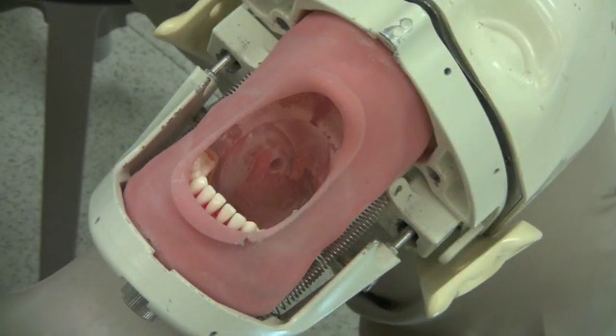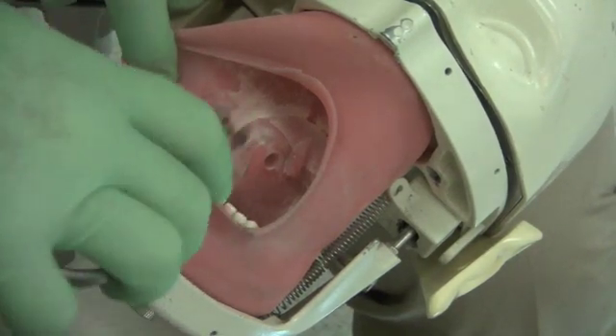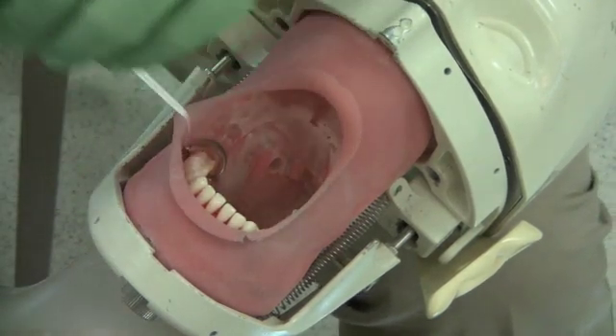The following video shows the steps for rubber dam placement. First, place the rubber dam clamp on the posterior tooth in a lingual to buccal direction.